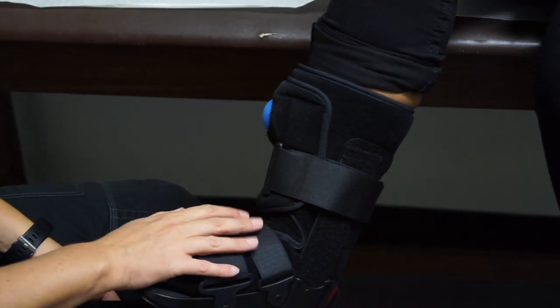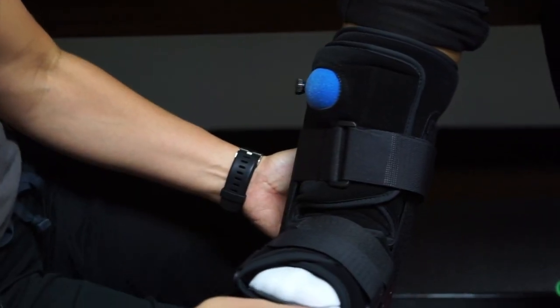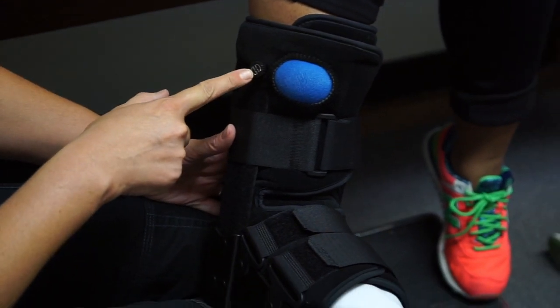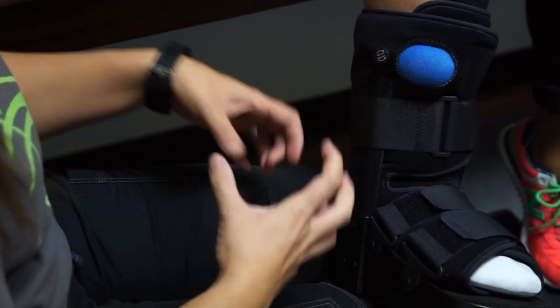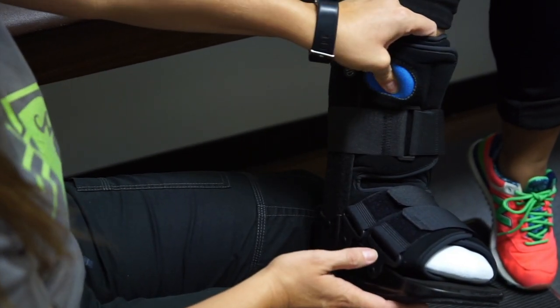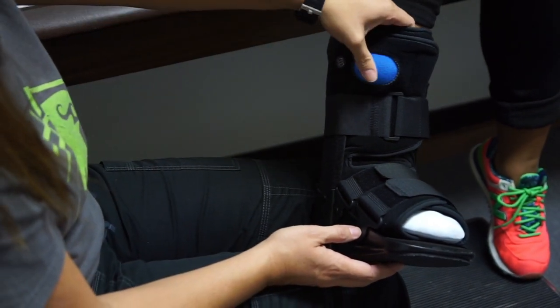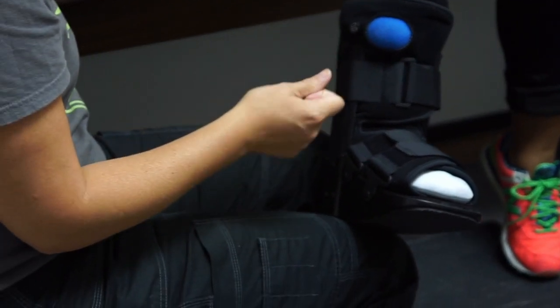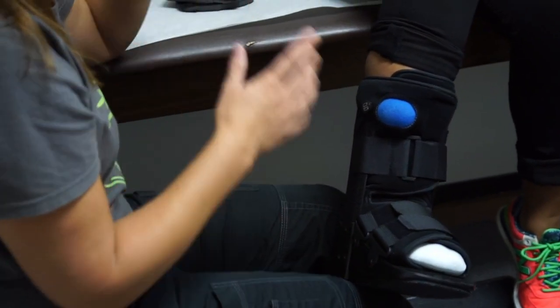Always make sure the patient can feel their toes and that they're not getting cold — they'll tell you if it's too tight. Our final step is to inflate the pump. The inflate side points clockwise, so turn it all the way until it stops — now it's ready to accept air. Do about four or five pumps to fill the air bladder. As the patient walks around, some air may seep out over time, so they only need to re-inflate about once every other day — though active young patients may need it more often.